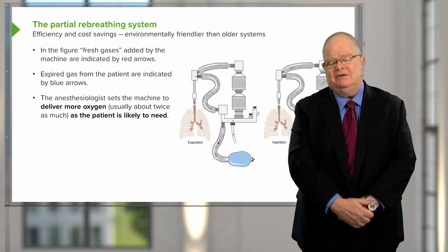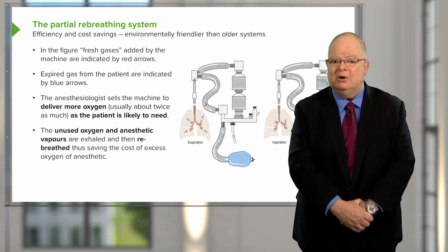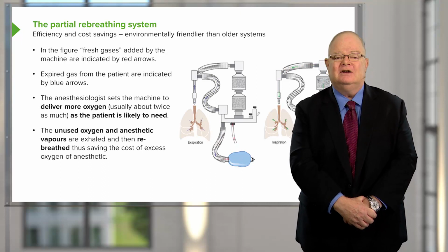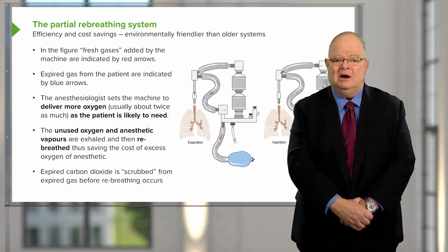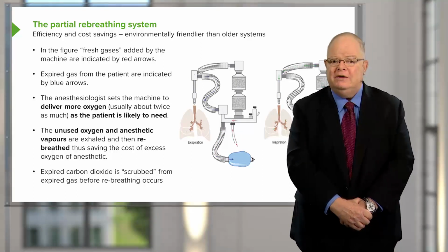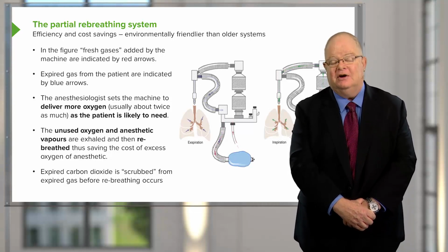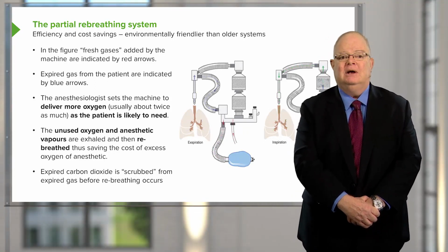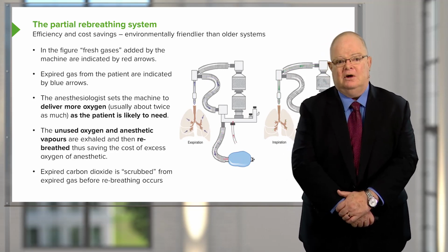The benefit of this kind of system is that we don't waste a lot of materials. So patients expire unused vapor and inspire it again, which allows them to continue to remain anesthetized, even rebreathing the same anesthetic vapor repeatedly. They get rid of carbon dioxide with every breath, and they get new oxygen with every breath. The overall waste of gas is very low. So we're not venting gas to the atmosphere, particularly seeing that vapors do have some environmental risks associated with them. And we're also maintaining cost effectiveness by reducing the amount of vapor that we use overall.